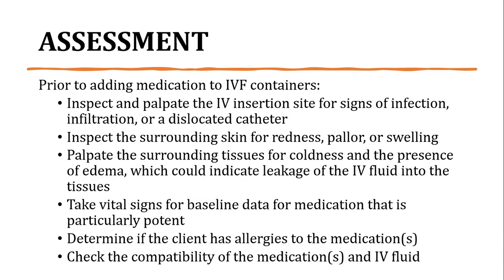Take vital signs for baseline data for medication that is particularly potent, and determine if the client has allergies to the medications, and check the compatibility of the medications and the IV fluid. Kailangan i-check po yung compatibility ng medications and IV fluid because yung ibang medications is hindi compatible sa IV fluid and minsan nag-cause ng precipitation kapag hinahalo sa IV fluid, which is makaharm sa client kapag na-administer siya na ganun.